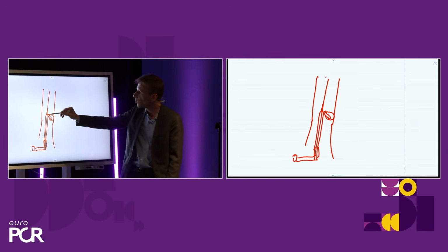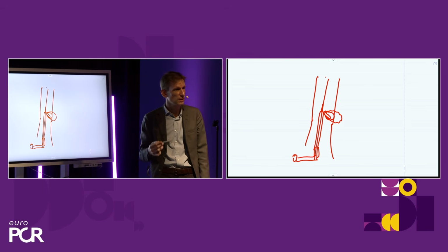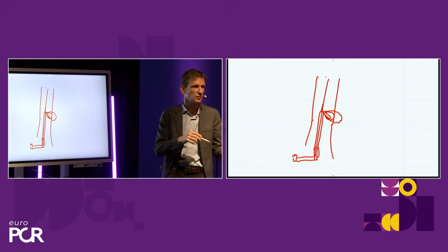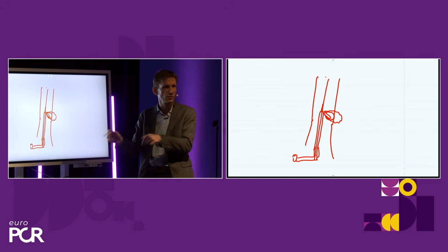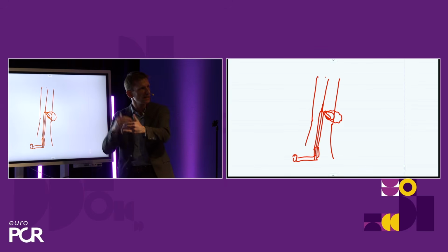If it's really more oozing than this, if it's oozing like that, then on that moment, what we do is supplement with the ProStyle. If you started out with 1 ProStyle, you put your second ProStyle there, or if you started out with 2, you can put your third one there. So it's like a stepwise scaling up.